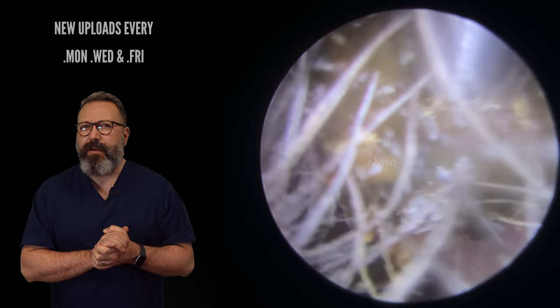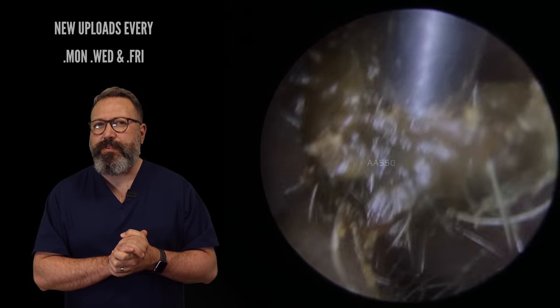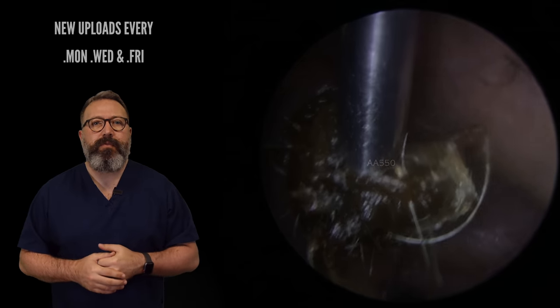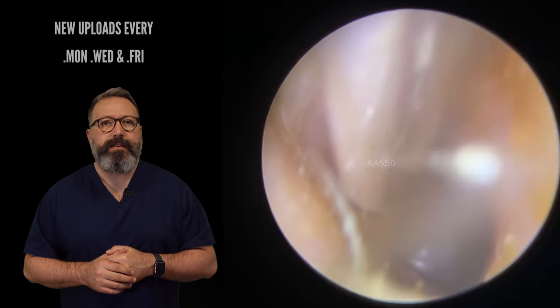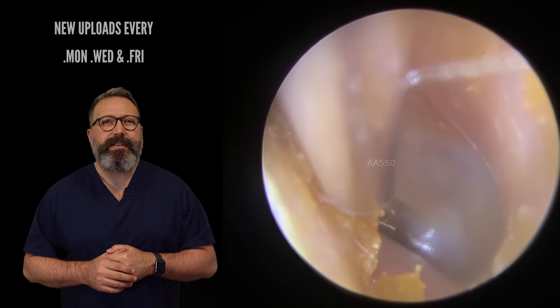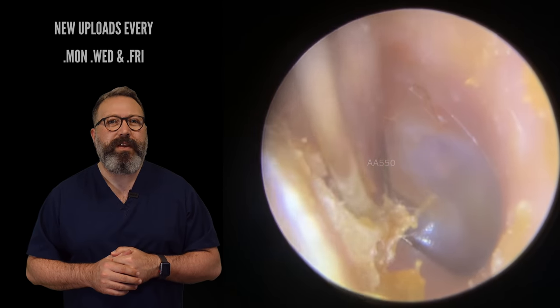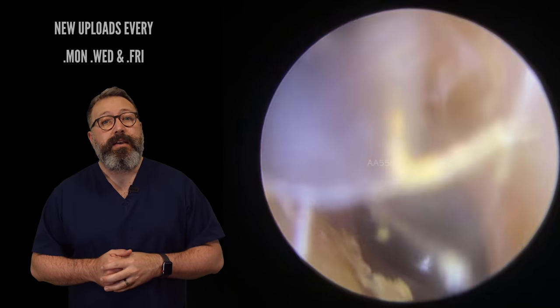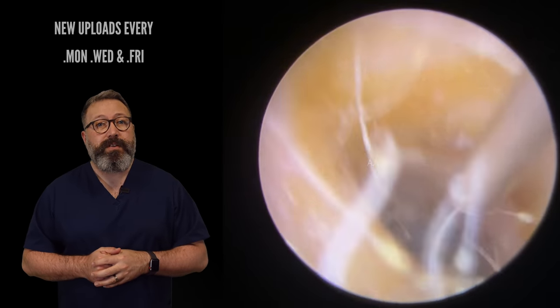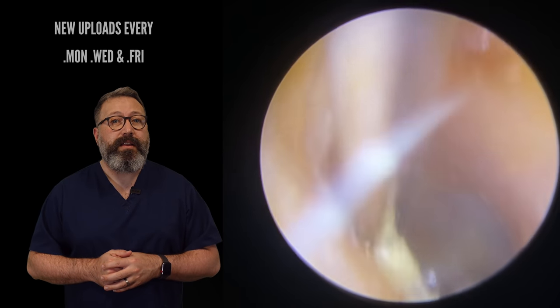I think we might have another wax removal after this one, but you can see it's come away really, really nicely. Let's take a look behind that. There's a tiny, tiny little bit left over on that one canal wall — it's mostly dry skin. You can see as we lift up that white material underneath — that's actually dry skin there. So we're just going to take that away, just snip the next bit off. We can see the eardrum beyond — it looks lovely and healthy.